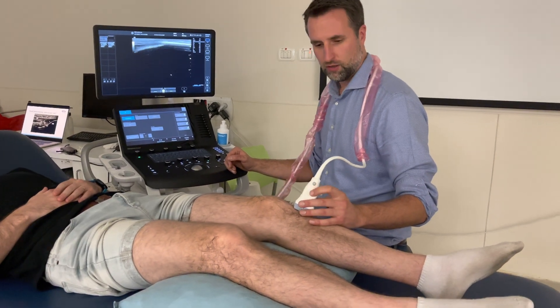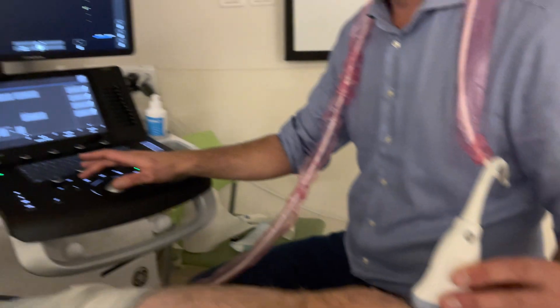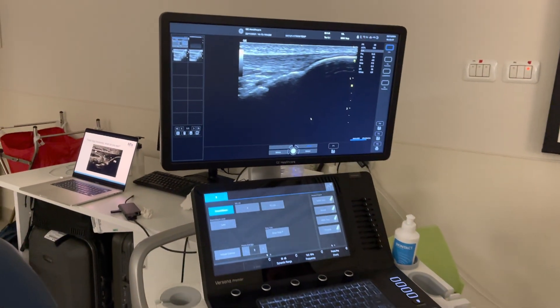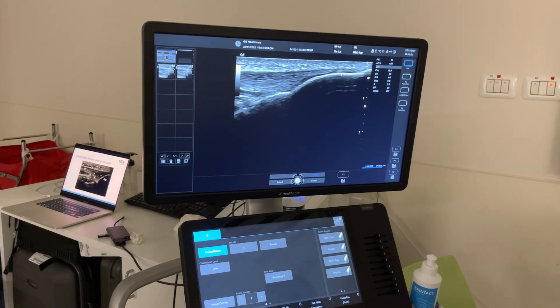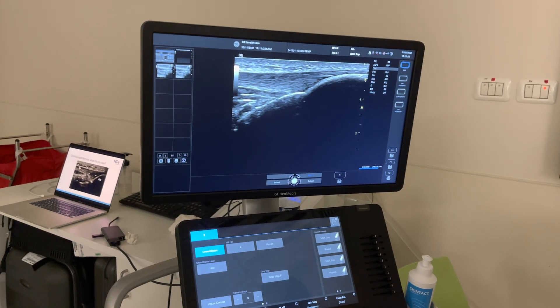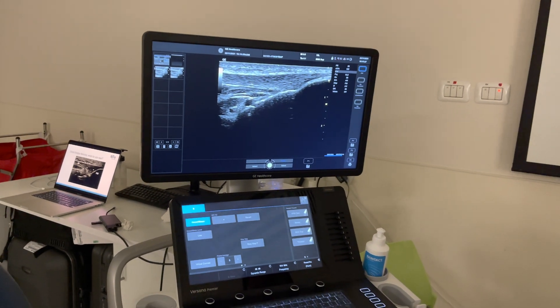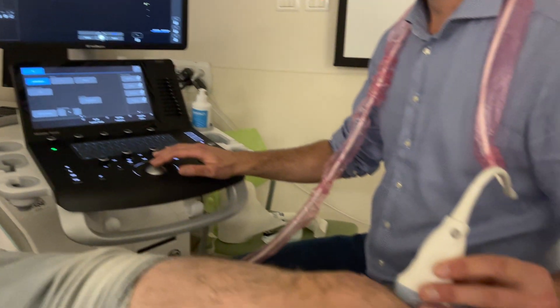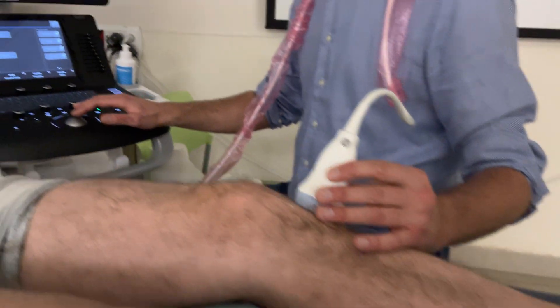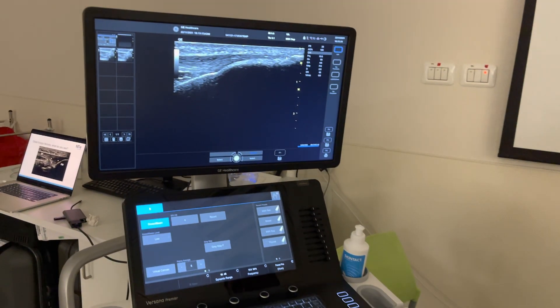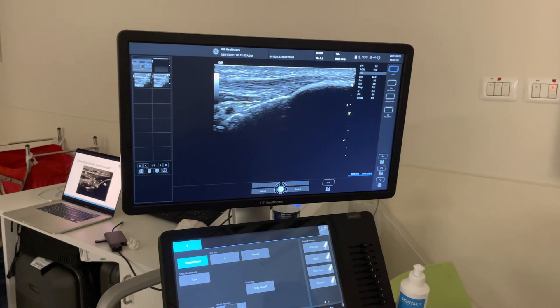We start here distally on the tuberosity, which you can see quite clearly. It's a very nice bone line — it goes down, not too steep, downwards, and then you see the patellar tendon attaching here. The superficial line goes on quite far, until here more or less, and the deep part ends here.